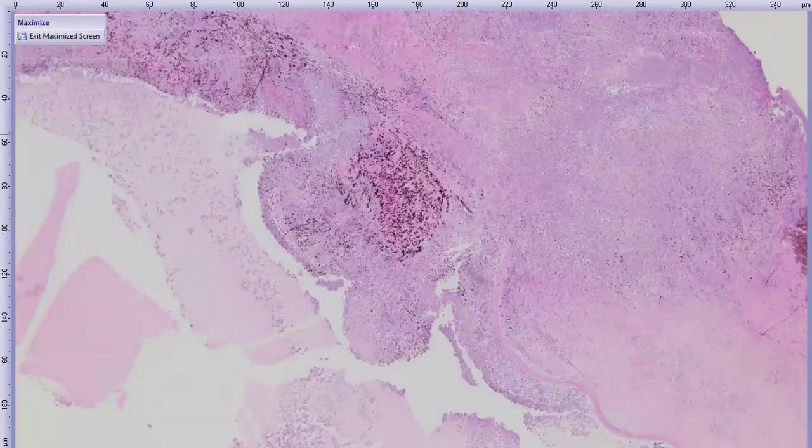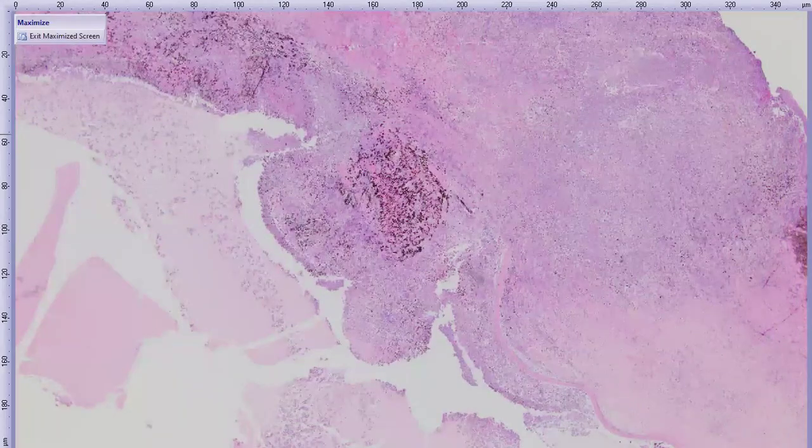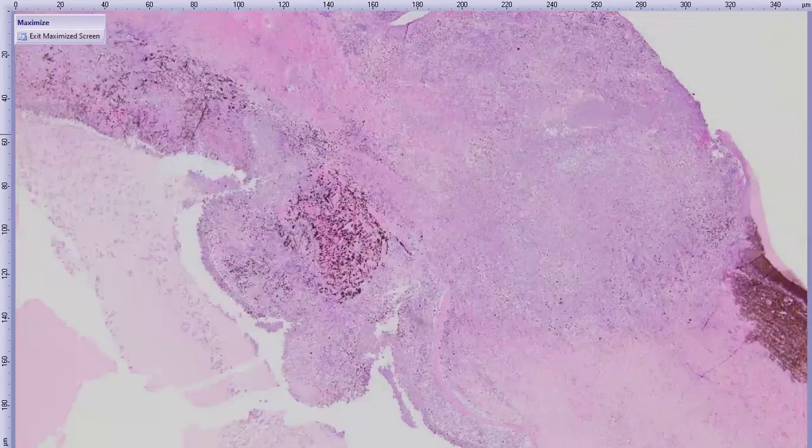Go ahead. I think I also speculated when Megan showed me this case that if enough lens protein was leaking through the capsule all at once, would that destabilize the structure of the lens capsule just because of how much liquefied stuff is in its substance? Yeah, I think that's an interesting thought too. And the way that there's that stippled, more brightly eosinophilic stain through the lens capsule is really interesting in this case. Yeah, just cool things to think about.